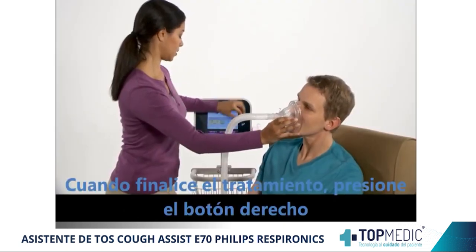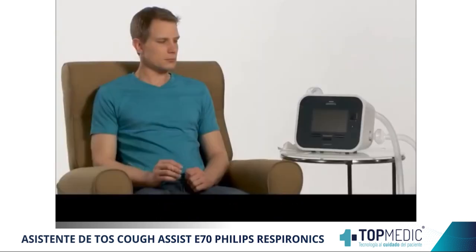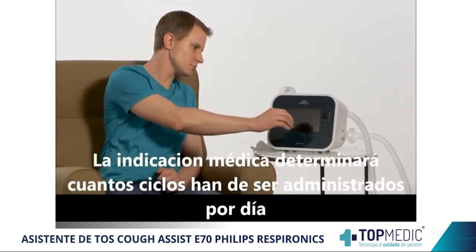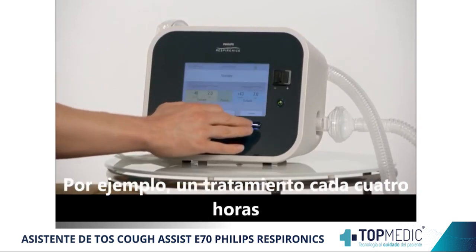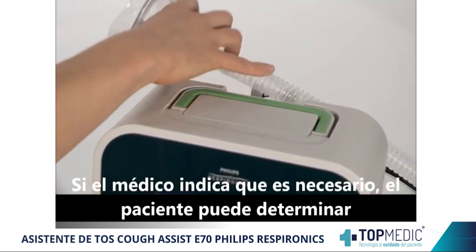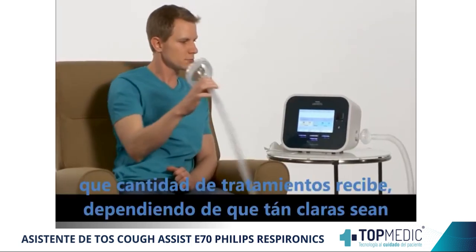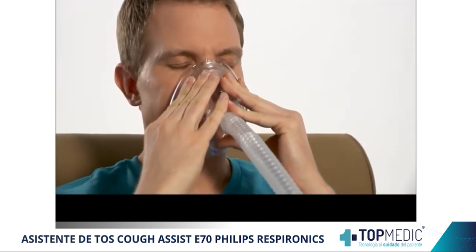When the treatment is finished, press the right button to halt the airflow and return to standby. The patient's prescription will determine how many treatments are to be administered each day, for example, a treatment every 4 hours. If the doctor orders the treatment as needed, the patient can determine how many treatments he receives during the day, depending on how often he's to clear secretions.